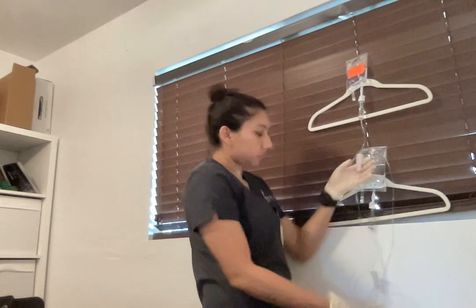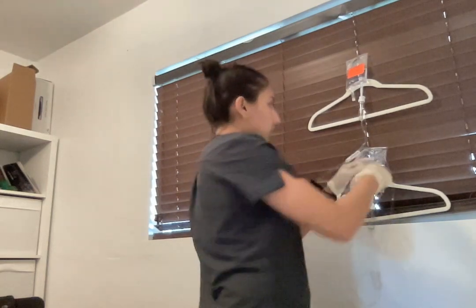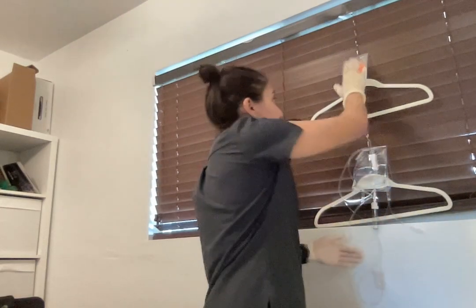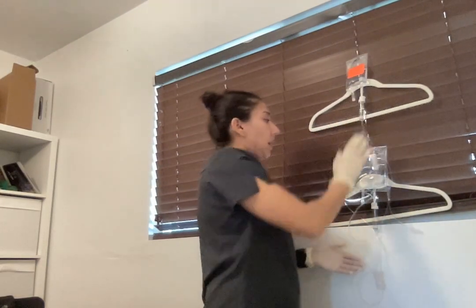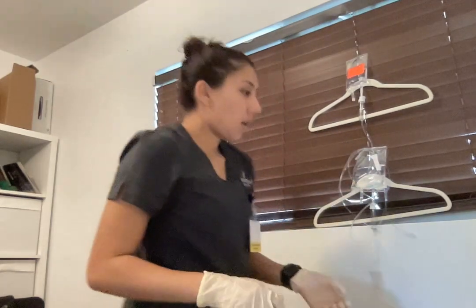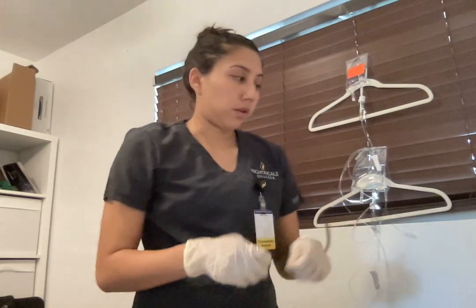Alright. So I would connect it to the patient. So the medication would be 100 drops per minute, and the fluid, 38. Then I would check the patient's IV site to see if there's any adverse effect with it or any discharge of the fluids or anything.